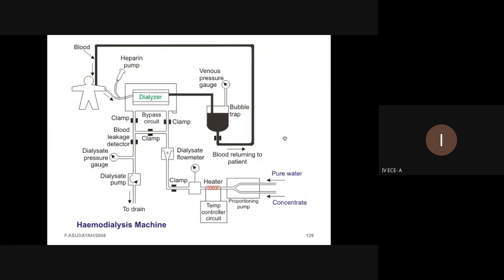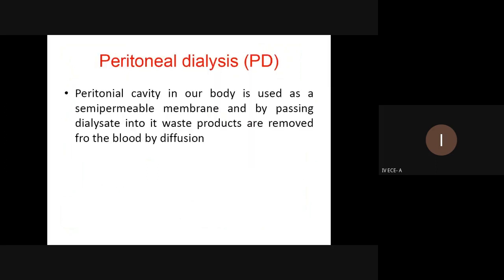Okay, so here the blood is given to the dialyzer. The dialyzer does some purification process by passing it through some permeable membrane. Then the purified blood goes through the body again. Okay, so this gives some relief to the patients.